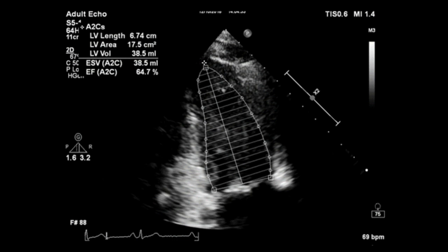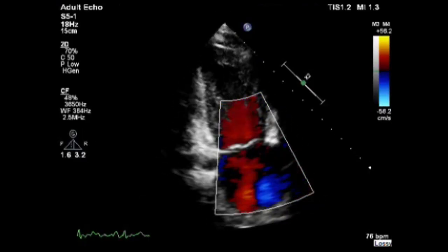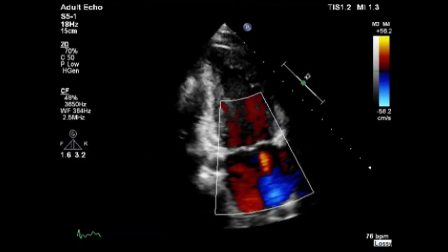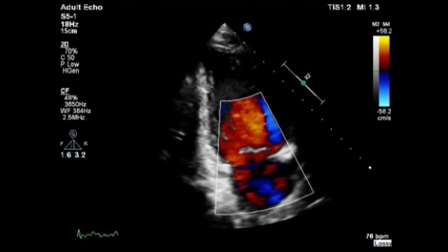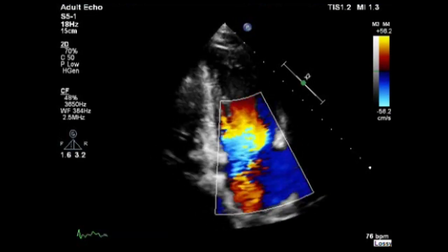Now continue with the assessment of the left atrial volume. Trace the inner aspect of the left atrial wall from the apical 4 chamber and 2 chamber views to obtain the biplane volume of the left atrium. Index this measurement to body surface area. Now use color Doppler to assess the blood flow across the mitral valve — look for abnormal, turbulent, or regurgitant flow.